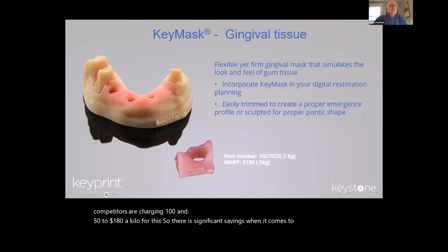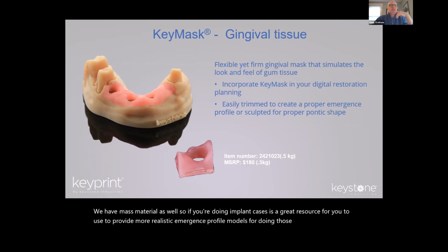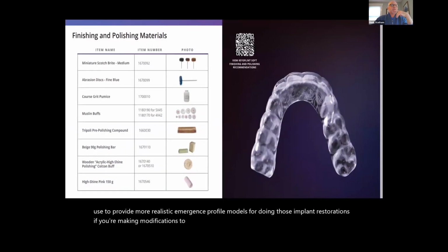We have mask material as well. If you're doing implant cases, this is a great resource to provide more realistic emergence profile models for doing those implant restorations if you're making modifications to the abutments. And we talked about that.